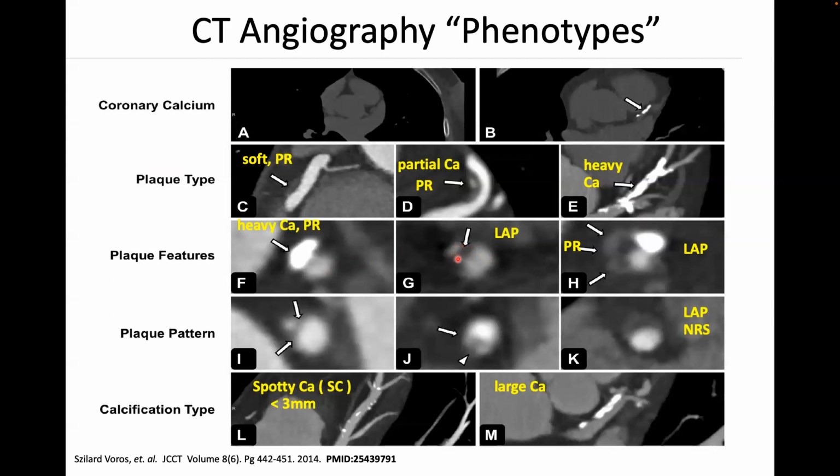Here, you basically have calcium, and then you have some soft plaque between the calcium and the lumen. And so it's called low attenuation plaque, which, now this is tricky. If you go down here and you say, well, this Hounsfield unit looks like fat.